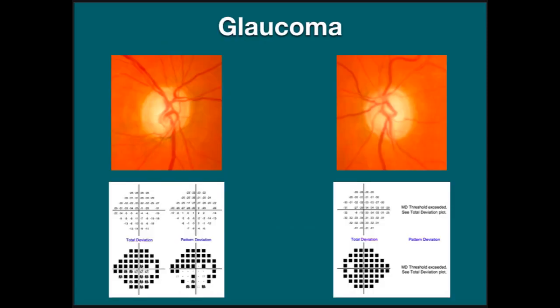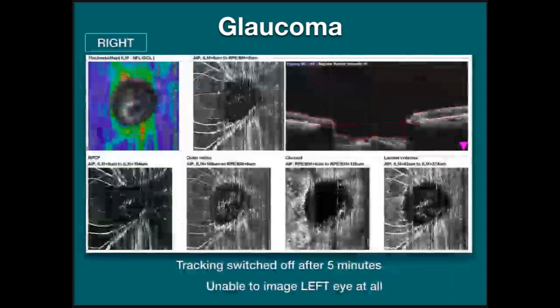So what does glaucoma look like with OCT angiography? This is your typical advanced glaucoma patient, typically asymmetric, so his left eye has both superior and inferior hemifield losses, while the right eye is a little bit less severe, with predominantly superior field loss related to a dense inferior neuroretinal rim loss in the right eye.